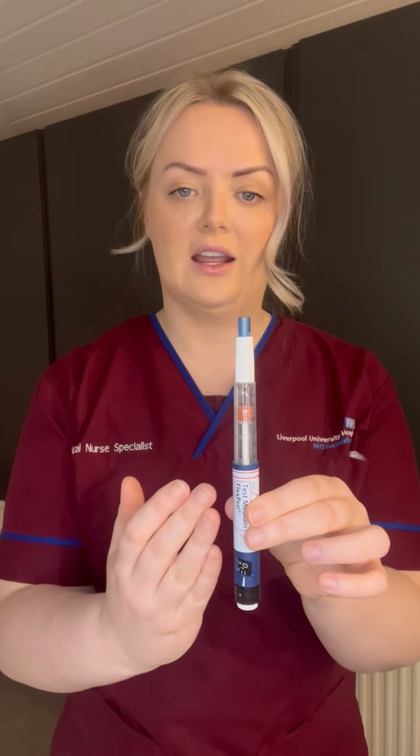So I want to make sure that the needle is attached to the pen correctly. So I'm just going to dial up a couple of units and do what we call an air shot. So I could see that that has come out, so I know that when I administer the dose to the patient, they are going to get the full dose because it's connected correctly. So if my patient was on 10 units, what I want to do is dial up to the number 10 as shown.